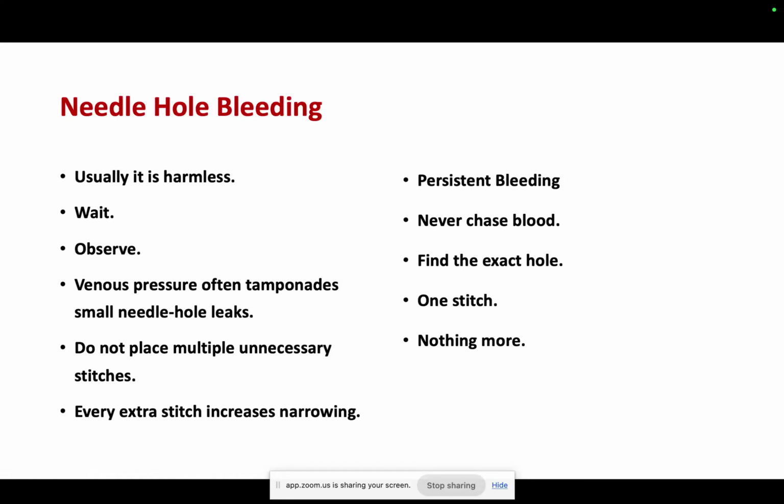So, you may mention 1 to 2 mm, right? Growth factor. Right. 2 mm, yes, sir. I mean, generally that's not the way you calculate it, right? Basically, it's a circumference. So obviously you don't measure the circumference. So you see the diameter of your anastomosis. And if you're going to use a single suture, then you ideally leave that much of a growth factor. How much, sir? Diameter one.